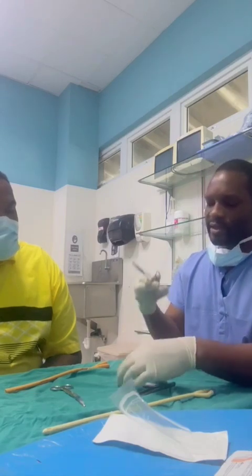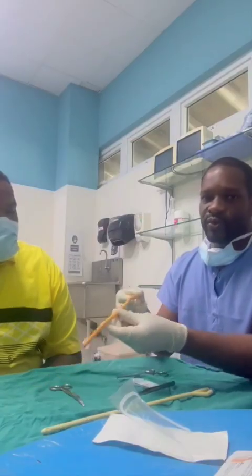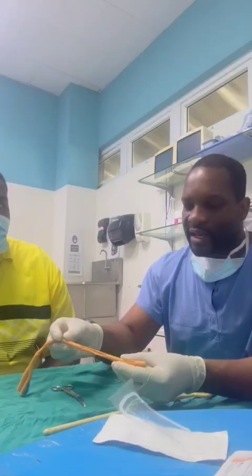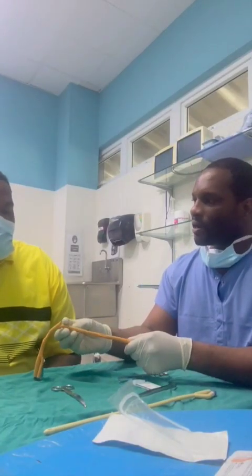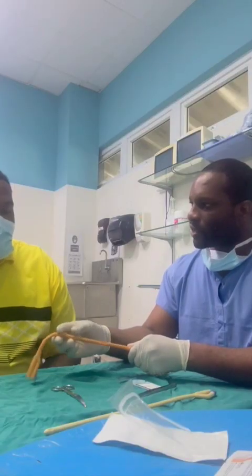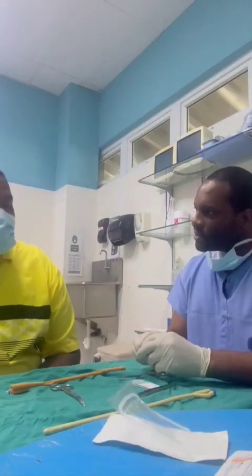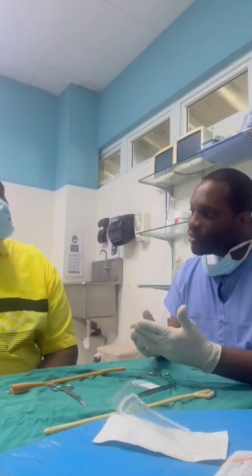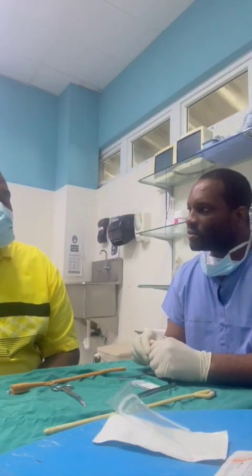Today we will be suturing our makeshift wound, which are incisions or cuts that I've made in a urinary catheter, so that we can suture these, remove them, and go again. Please remember, at any stage in the demonstration, anything you don't understand, please feel free to let me know. We'll clarify it and ensure that you understand very well by the end of today's session. Noted.